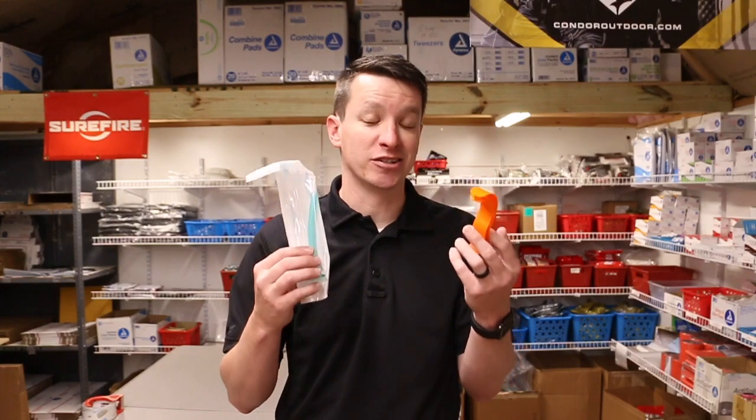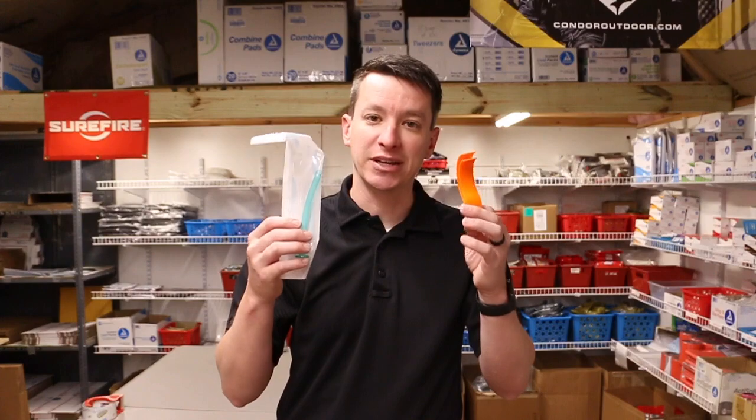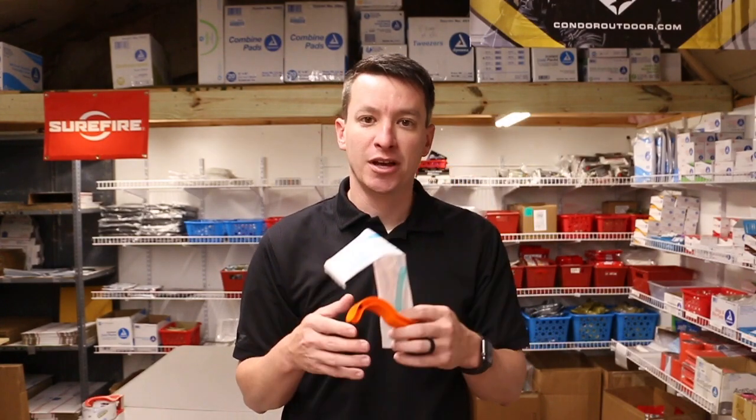So in this video, I want to talk about when you should be using an airway adjunct, such as an OPA or NPA. Now, I've already done videos on how to place these. Pretty simple, but it does take some training. But one of the questions I get a lot, whether it be in my inbox or classes, is when should you use this? So the simple answer is when the patient cannot cough or swallow.